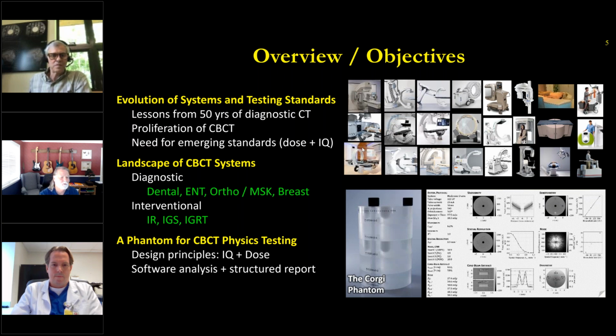Jeff will talk about cone beam systems, as you see a medley of images of those on the upper right, and for both diagnostic with dental, ENT, ortho, musculoskeletal, and breast, and interventional, which is really his area of expertise, with interventional radiology, image-guided surgery, and image-guided radiation therapy.